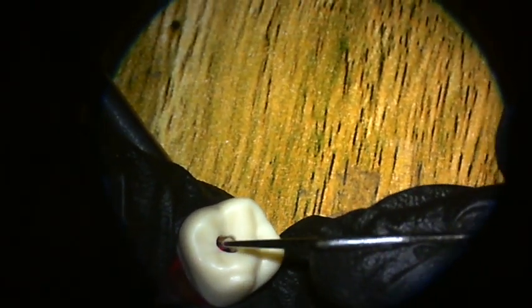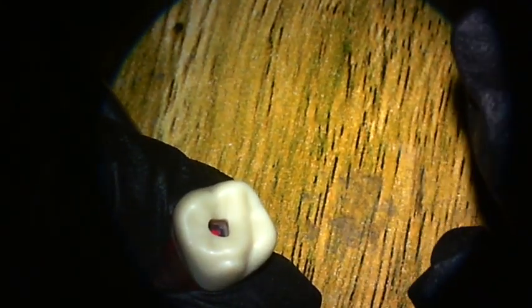It must be very gentle so that you can catch any minor access pulp horn, because if you are pulling it forcefully upward, you will not feel the catch. It will disappear. So we are following the tactile sensation, right? There should be no catch.